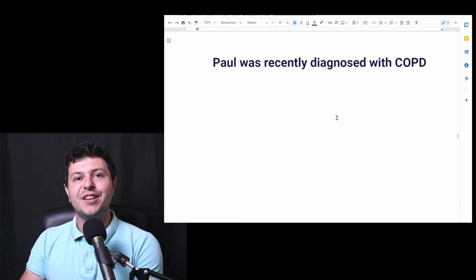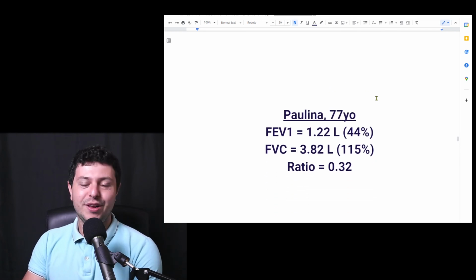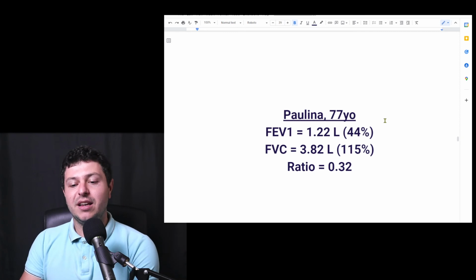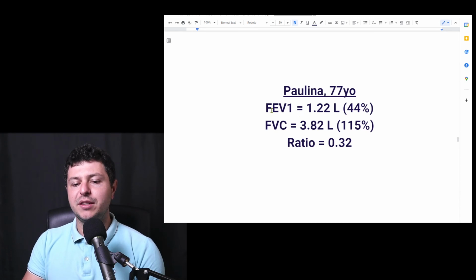Let's move on. Another example. I like these examples. Paulina. All right, so Paul and Paulina. Paulina, she is 77 years old. So she's also done a spirometry. And we see that her FEV1 is very abnormal, right? So 1.22 liters.